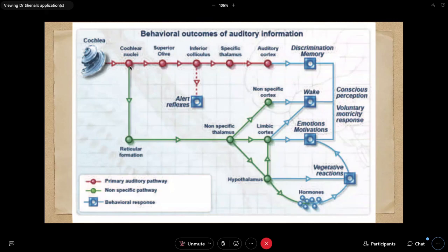So let us see how the cochlear implant has developed. There have been five eras. Initially, there were forerunners, then some experimentation done by pioneers, then the feasibility was evaluated. Then we got commercial implants coming in with multi-channel electrodes. Finally, there was the development of the brainstem implant. So we see here, Volta was one person. We all know what a volt is.